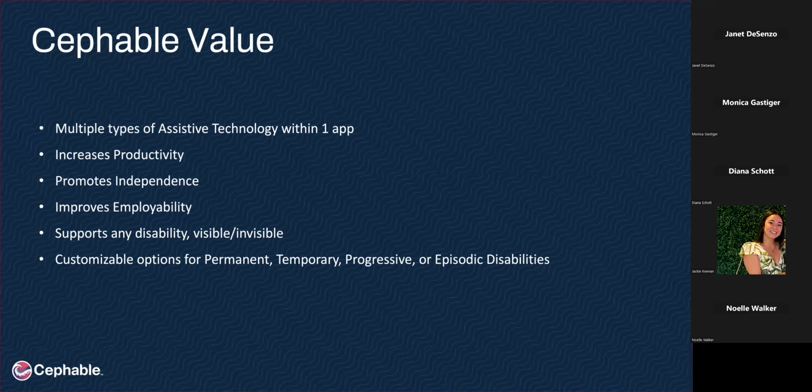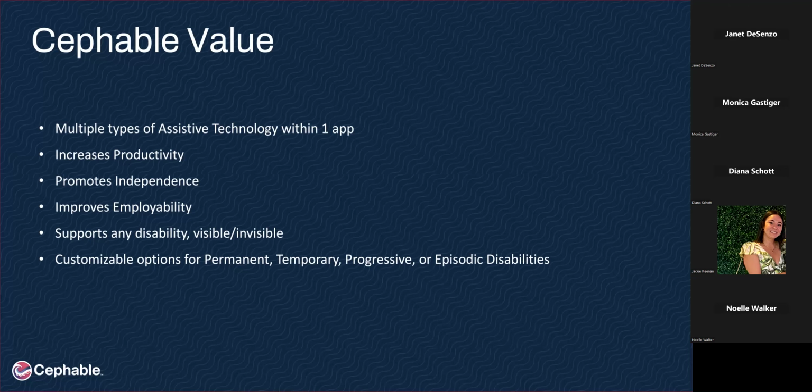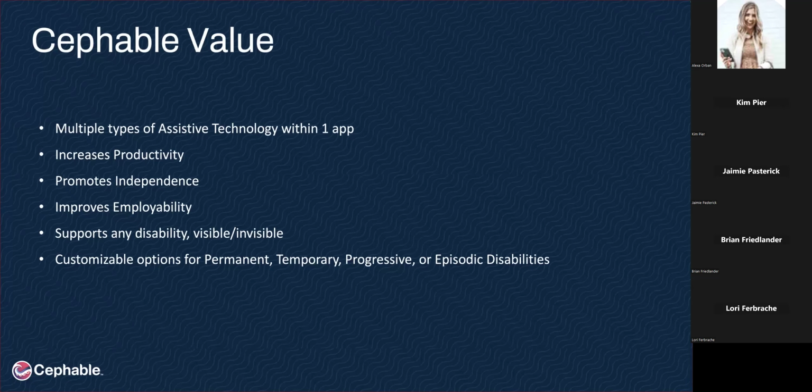That's one thing we're seeing with our software: given this large menu of different inputs, we can offer some sort of value to a lot of different types of accessibility needs in one app, versus having to have lots of different pieces of hardware that have a myopic, single focus. That's been really exciting, especially coming into this company as a therapist myself. We know that one size doesn't fit all in a lot of spaces, and definitely not in assistive technology. So that's been really exciting.